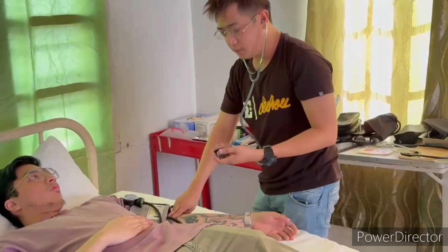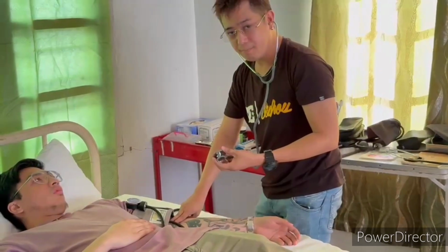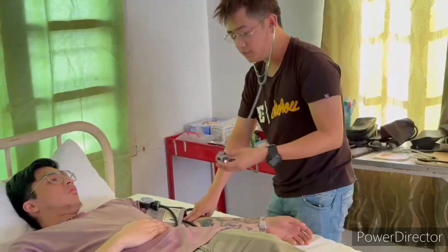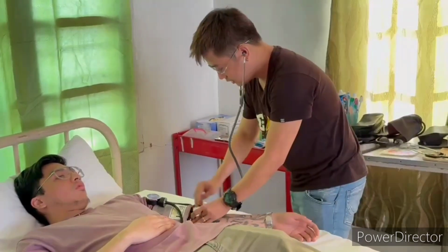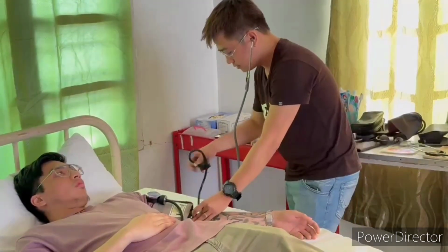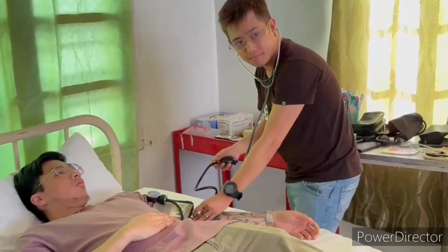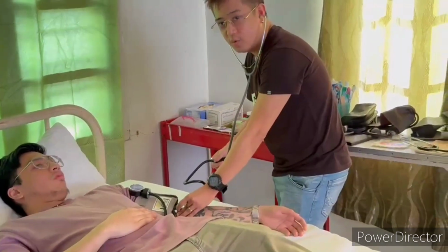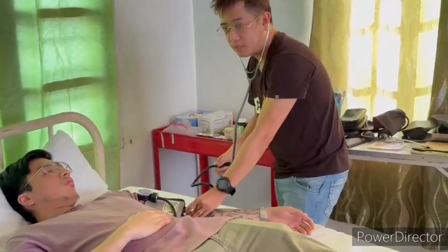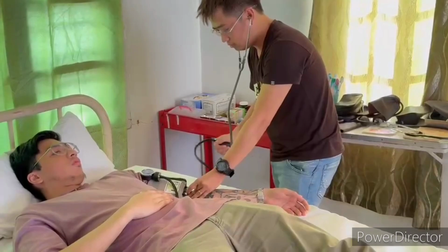Okay? Once you found the brachial area of the patient, put the chest piece on it. And then you may start inflating the cuff using the valve pump. Okay, since the patient is in a good condition, we just have to inflate the cuff for about 160 to 180 millimeter mercury. So inflating the cuff now.